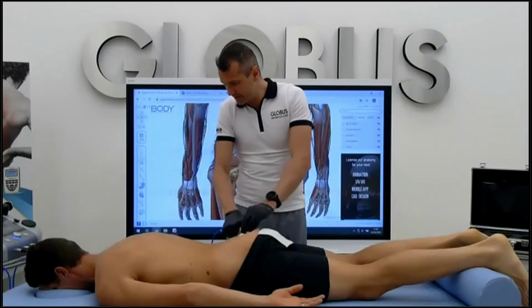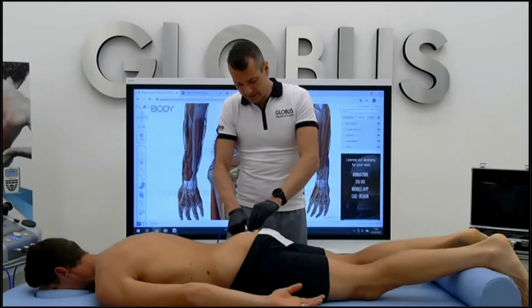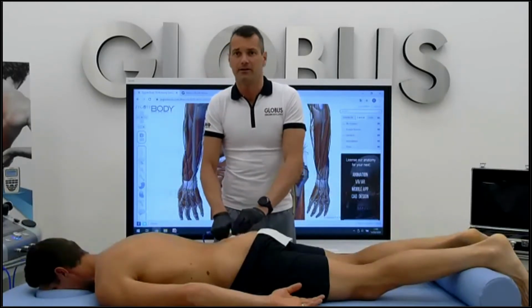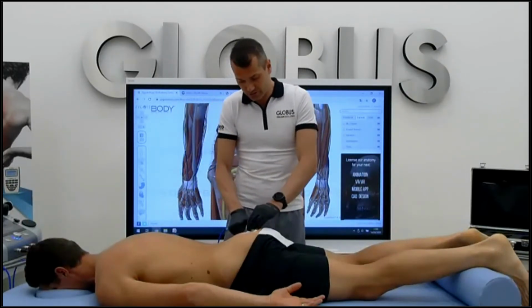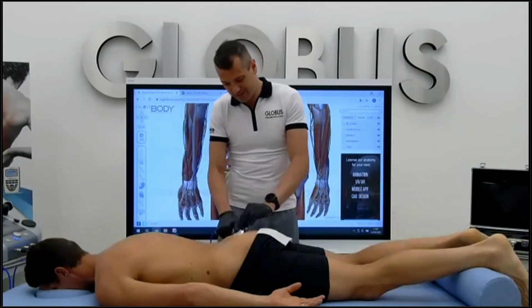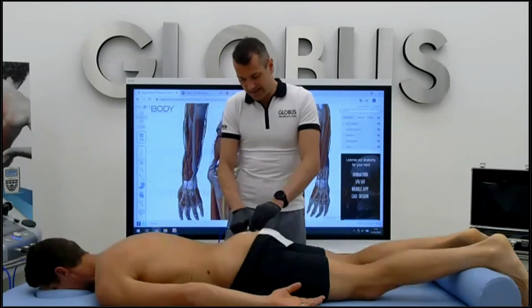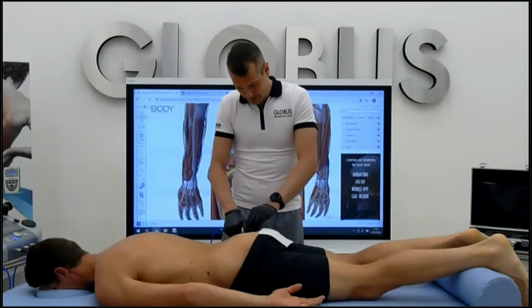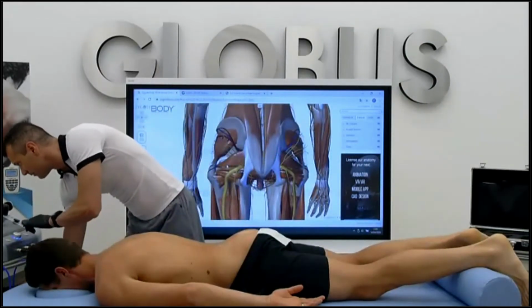Does it hurt? No. Okay, no pain for Damiano, and I'm using quite good energy. I'm using 40 watts on the fascia tool program. There is a special program on the machine to be very specific. It's a program that has a maximum of 50 watts of power. This could be an easy way to start, for example.